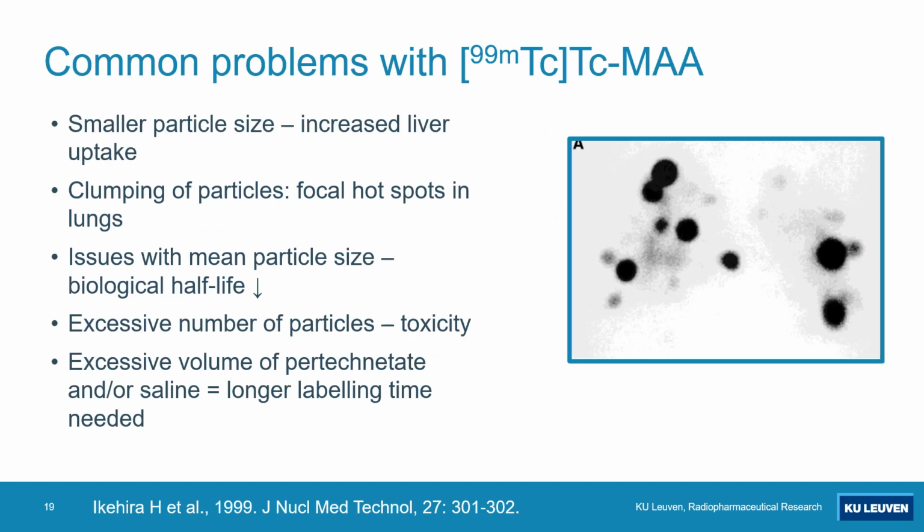Technetium MAA could result in clumping. So you could get focal hotspots, which is quite spectacular, and you would be able to see it. It can also lead to issues with the mean particle size, with lower biological half-life if there are smaller sizes, or if you use a too old eluate with less technetium concentration, you will have an excessive number of particles that can lead to toxicity.